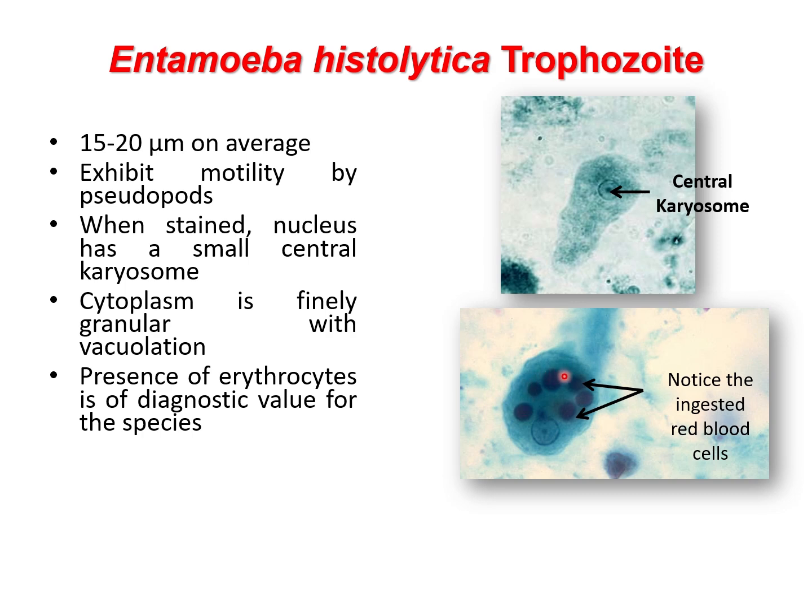And more importantly, when you look at trophozoites of Entamoeba histolytica, you might see several red blood cells inside the trophozoite. So on this trophozoite, for example, you can see 6 RBCs that were ingested, as well as the nucleus that contains the central karyosome. Remember that the diarrhea caused by Entamoeba histolytica is bloody, and this is called dysentery. This is mostly due to the lysis of the intestinal mucosa by the trophozoites, leading to this bloody diarrhea. Of note, these trophozoites feed both on RBCs and on bacteria of our intestine.